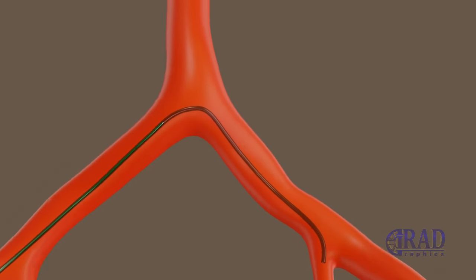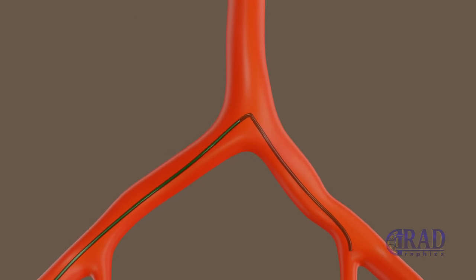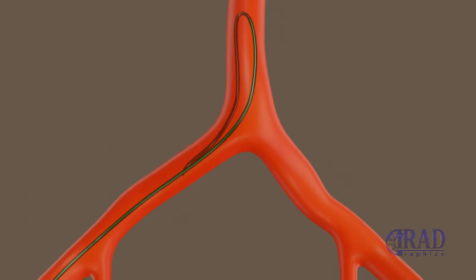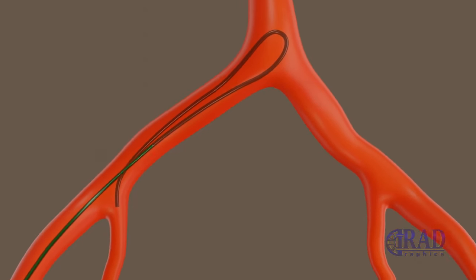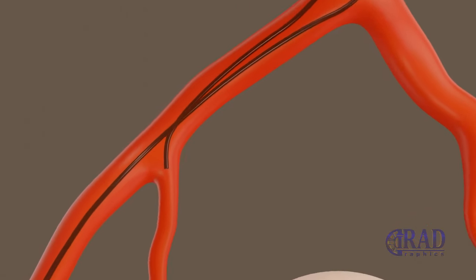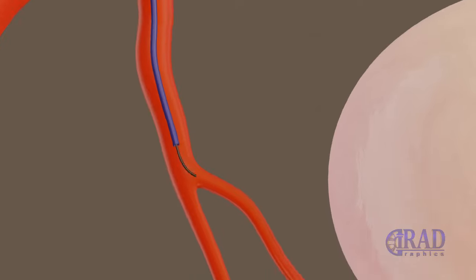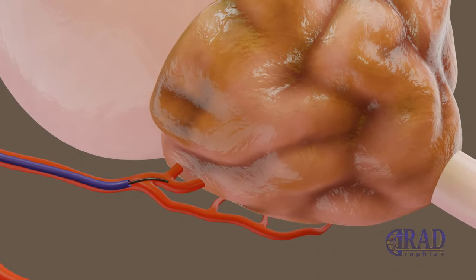The wire is advanced back to the base catheter. This combination is pulled back while performing a special maneuver to form a Waltman loop in the lower abdominal aorta. This form of angled catheter is then advanced to select the ipsilateral common iliac and then internal iliac artery. The wire is removed and the combination of microcatheter and microwire is again advanced to bypass unwanted collaterals in similar fashion until the prostate artery is sub-selectively catheterized.